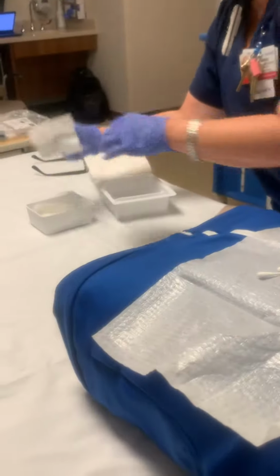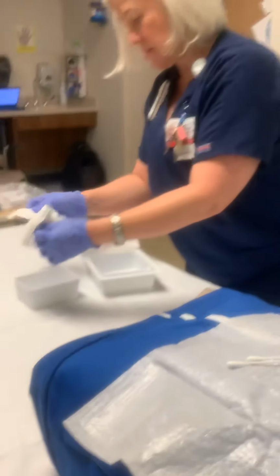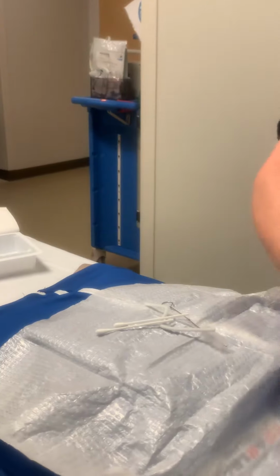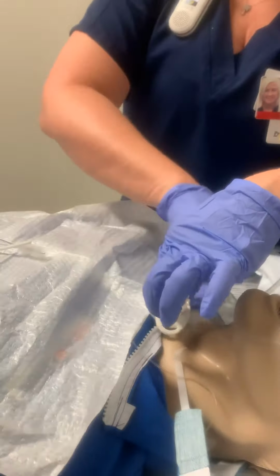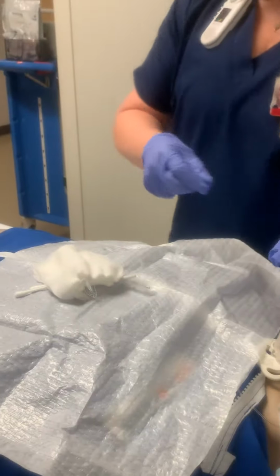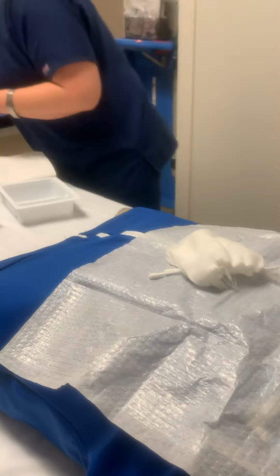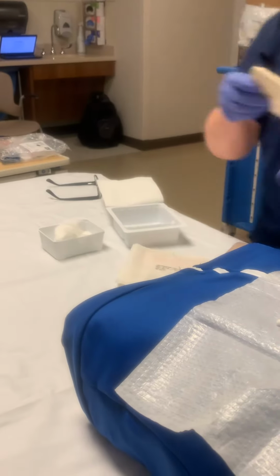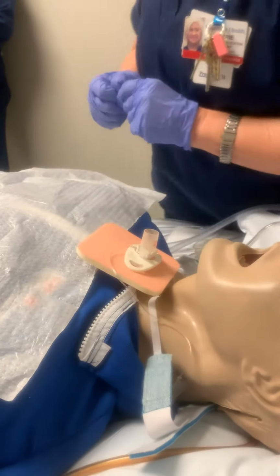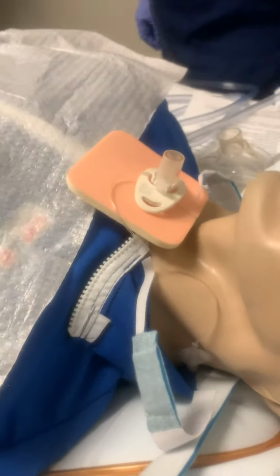Then they're going to give you those soft wicks. I don't like these. I like my Alevyns, but it doesn't matter, it's fine. Then I'll put it in here, and I like to clean around my trach, all around underneath here. Okay, so it's now nice and clean. Then I will put my Alevyn underneath here, which is what I prefer. So I always like to have my Alevyn out, and then I'll put my Alevyn underneath there, and then retie.